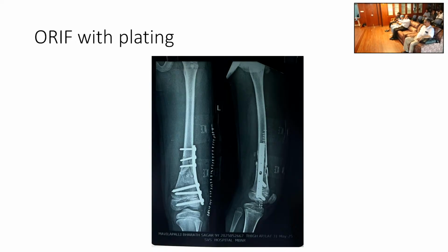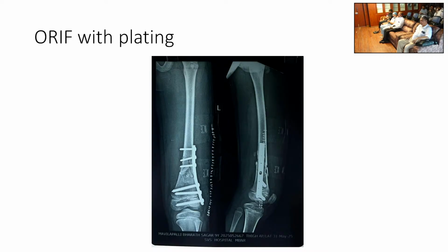And now the medial column is left open. The lateral column is under compression. If you leave it for 12 weeks, not 1 year, then you will come with a valgus deformity.